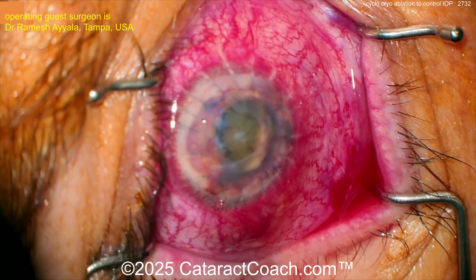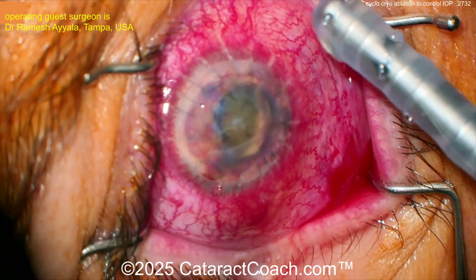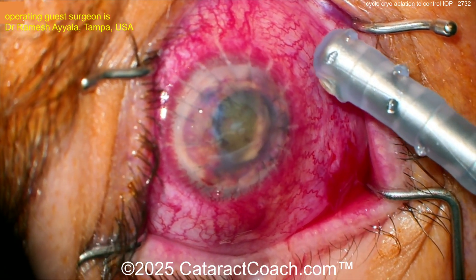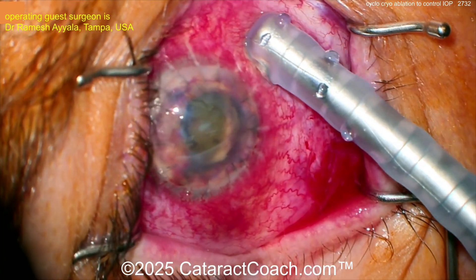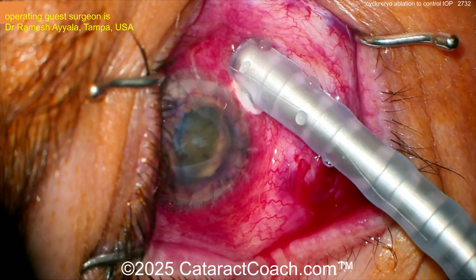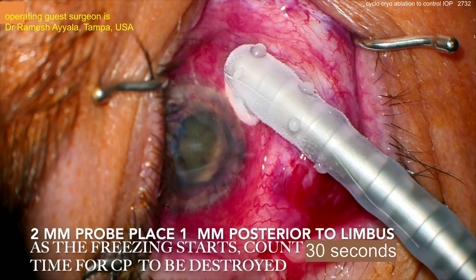You're going to use this for cyclocryoablation. Putting the cryoprobe down here — don't go on the cornea, you're going to go posterior to that, about a millimeter back from the limbus. Put the probe down and here's the key: when you're applying the cold, you've got to give it time to work. Step on the pedal. How long do you wait? About 30 seconds.